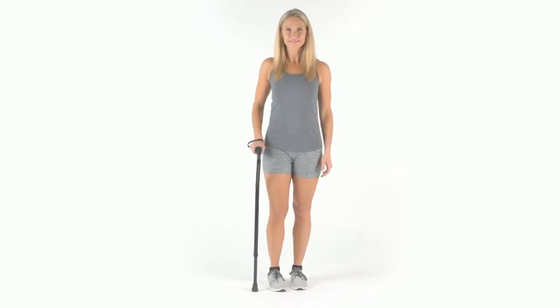The Walking Cane by VIVE is trusted and proven. There are hundreds of five-star reviews. Plus, it's backed by an unconditional lifetime guarantee. You can't beat that anywhere. So confidently order yours now for safety and support wherever you go.